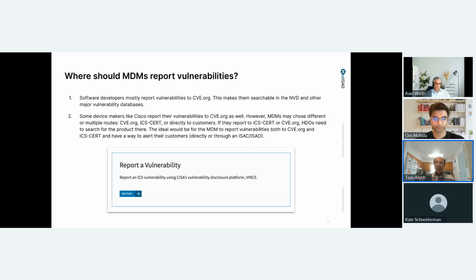I do have a problem if the medical device maker only reports to their customers and nowhere else, because then nobody other than their customers can learn about vulnerabilities. And if someone's trying to compare devices for their security posture, they can't do that. So that's the problem there. But I think they should be reported either to cve.org or ICS CERT, or perhaps both.